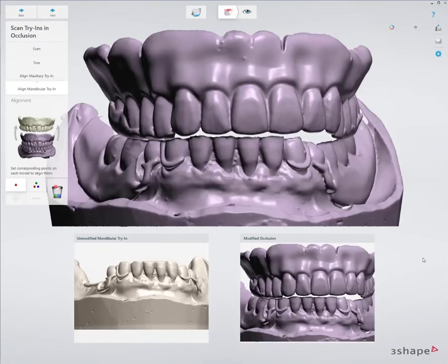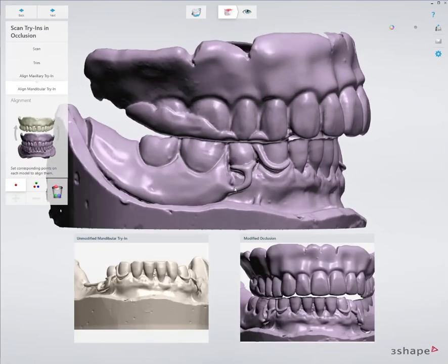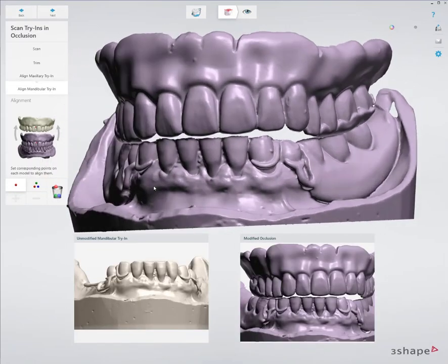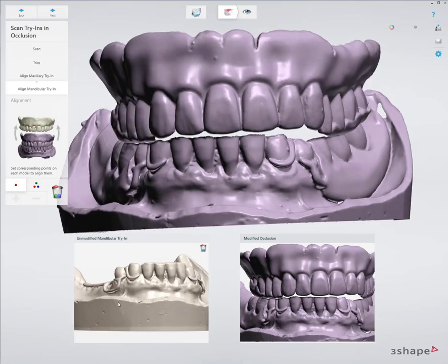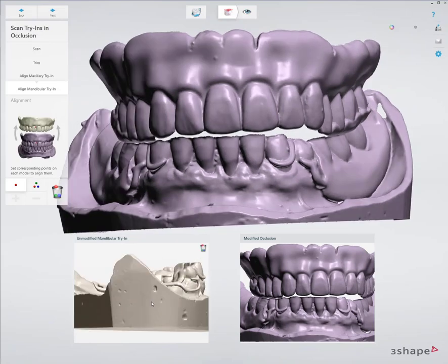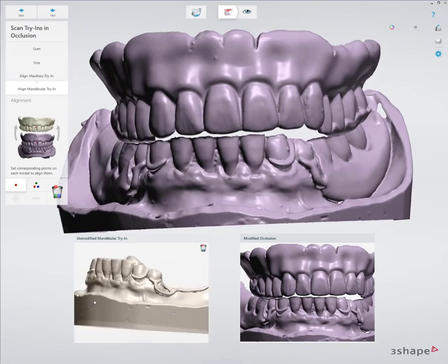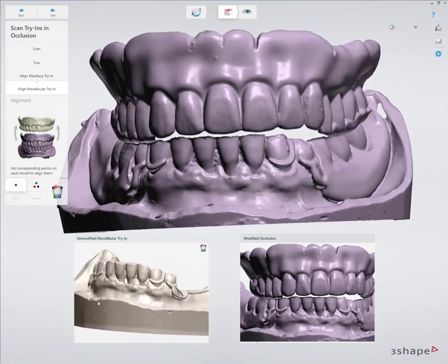And when I go to align the lower, I'm now going to have the model to align it to. This way I know that the new bite is going to be the most accurately scanned in because I actually have points to align it to.